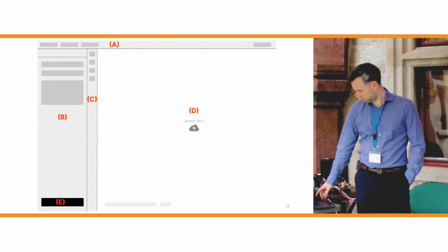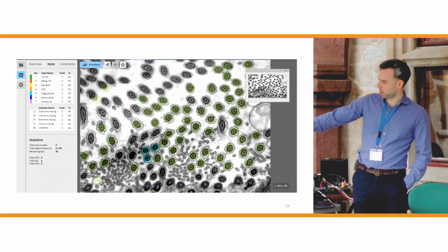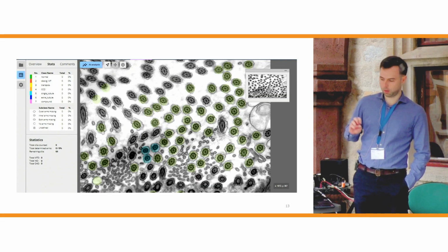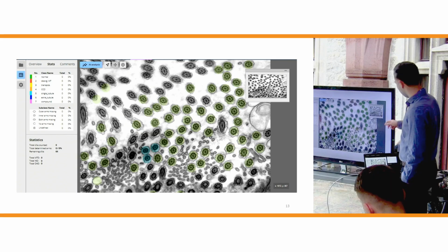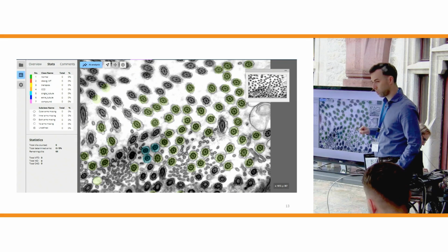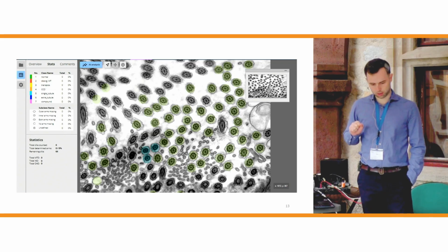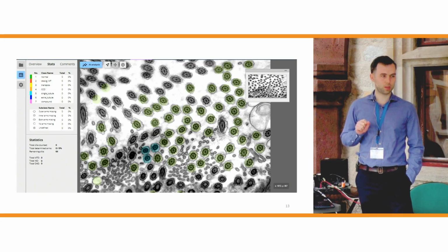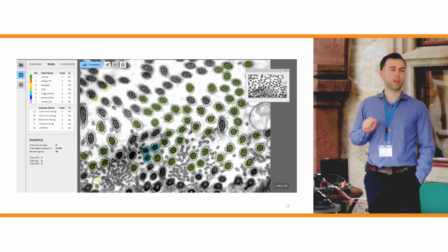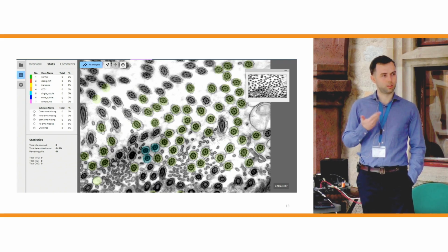And this is more interesting. Here we can see an example use of our prototype, because the design is still in development. Here we can see the cilia, and on the left we can see the classifications, which are derived from the Southampton notation, and after discussion with our domain expert, we came to a conclusion that this standard can be a default standard in the European Union.